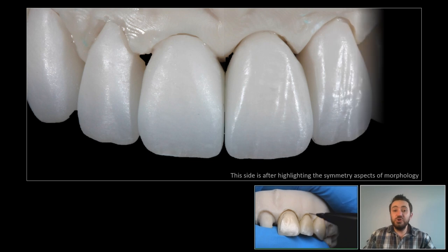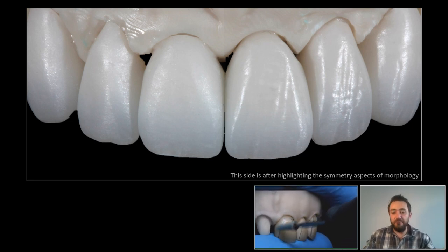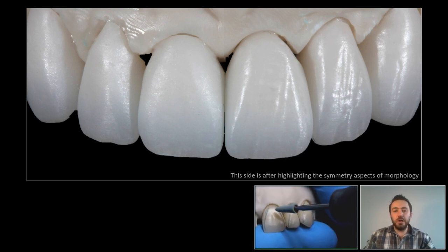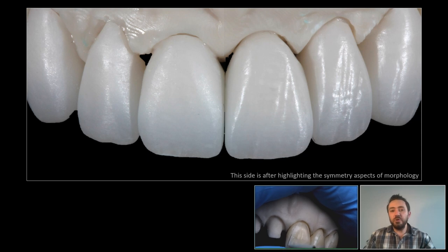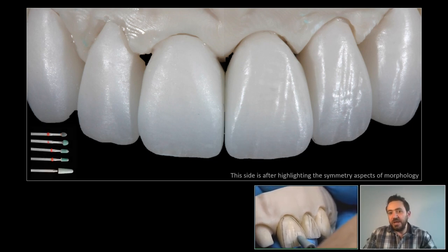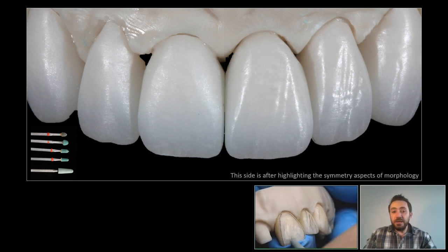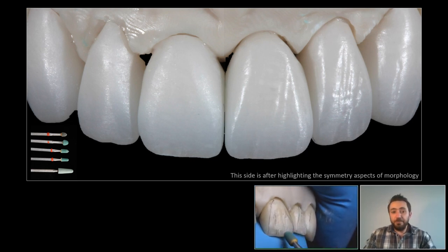Then we move to the third step of accentuating the transition line angles and controlling the symmetry aspects of morphology between the two sides of the teeth arrangement. With the help of either a regular pencil, a pen, or a direct light source hitting the buccal surface of our case — as you see here — we start carving the microtexture, which is a very necessary process for restoring all the three-dimensional features that natural teeth have. For that, on a very slow speed, I would use eroded green stone burrs like these you see here. With the fine used tips, we can carve the pattern of texture that we intend to have through the entire case.